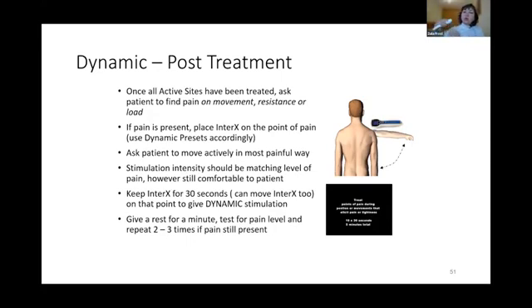So same on the move, they say, it's here. And at this point, when they say, it's there, you need to put it there and focus. And when you focus, you create the dominance again. And it's very important, 30 seconds or slightly rubbing it, 30 seconds, and then stay.